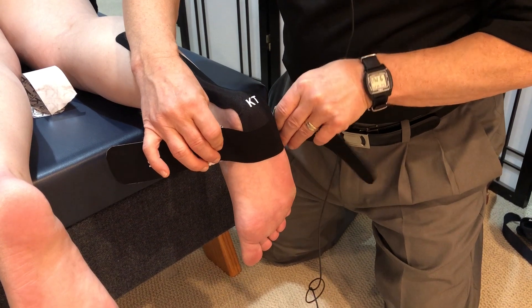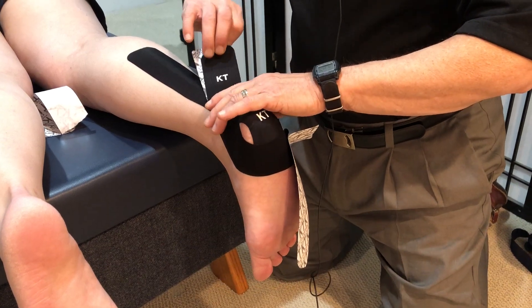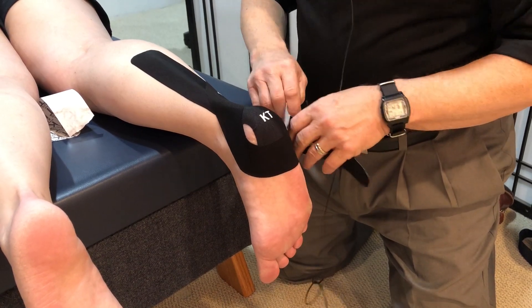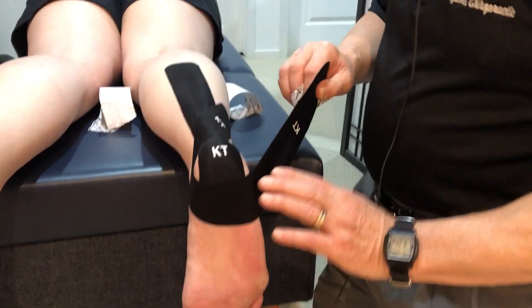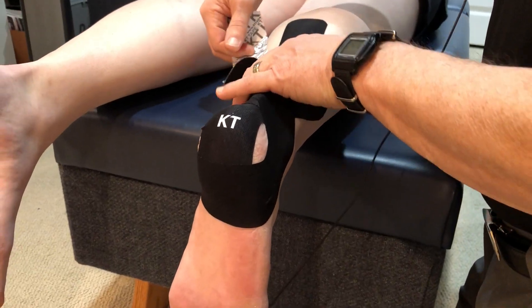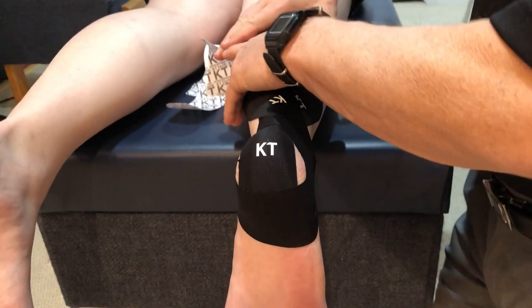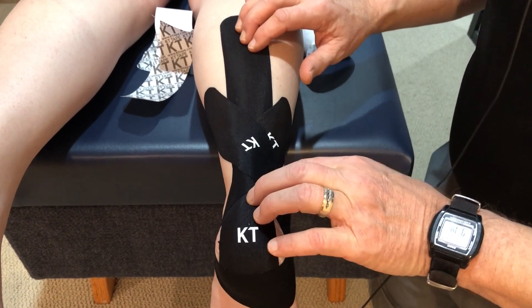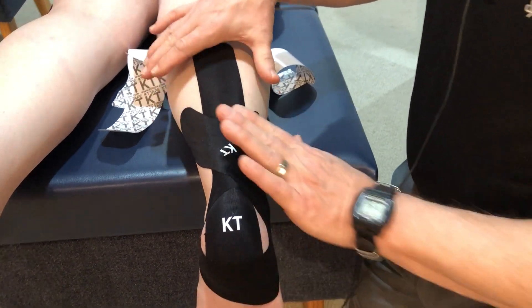I'm going to place that right there, then this is going to go up and over the Achilles, spiraling up the leg. I'm going to bring that up and over, rub all the tape in to set the adhesive. So now when we want a little bit more support than just from the single strip of tape, we can do this with the addition of the spiral pattern and get even greater support for the Achilles.